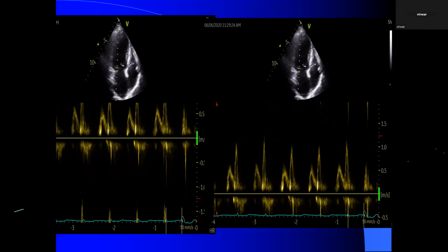Sir, just out of interest, I have a query. Suppose the aortic flow is of high velocity, it should be continuous wave Doppler. Is it not possible to set the velocity limit to 6 and then use pulse wave Doppler? No, with continuous wave Doppler, your question is that it is a disease flow, correct? Yes, sir. Suppose you have put a CW Doppler, and even by putting 4 meters per second, it is not coming within the whole velocity scale. Make it 5. Depending upon the velocity, the main thing is that the whole velocity profile should be available.